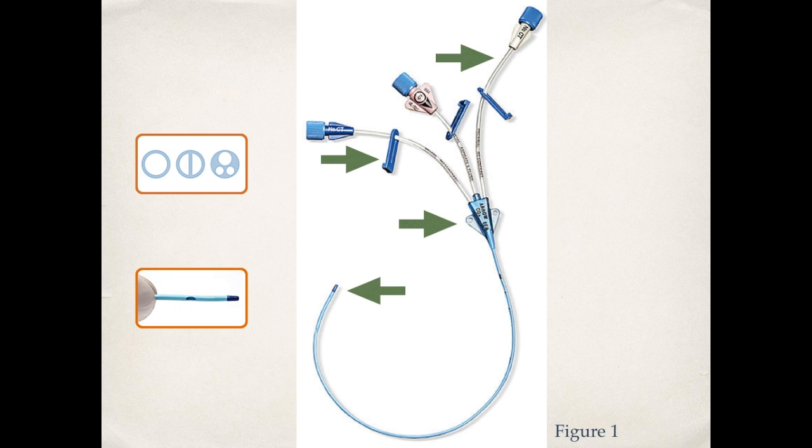So this is the catheter tip, and it's a soft contoured tip to reduce any harm or aggravation to the veins, and it's nice and flexible. And you can see on the left hand side there's actually different exit points for each lumen, so they exit the catheter tip at different lengths so that the drugs won't actually combine and cause any adverse reactions.